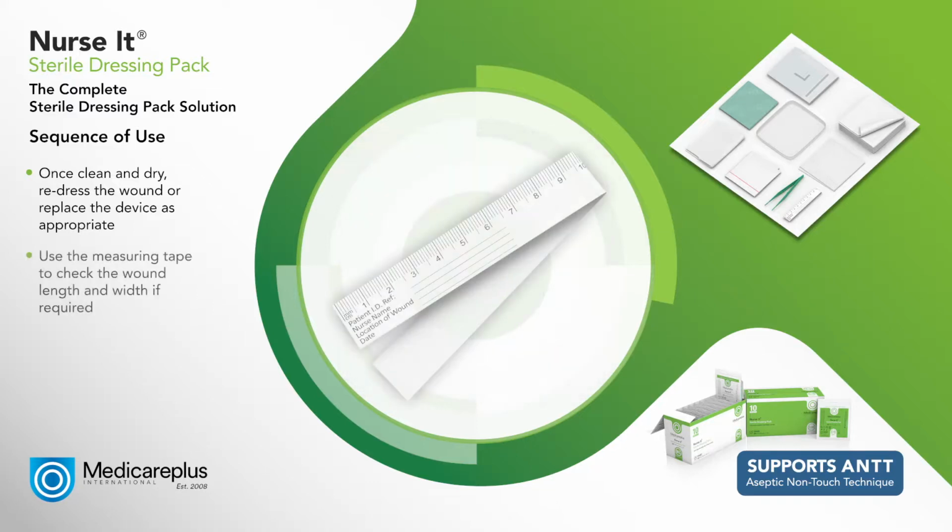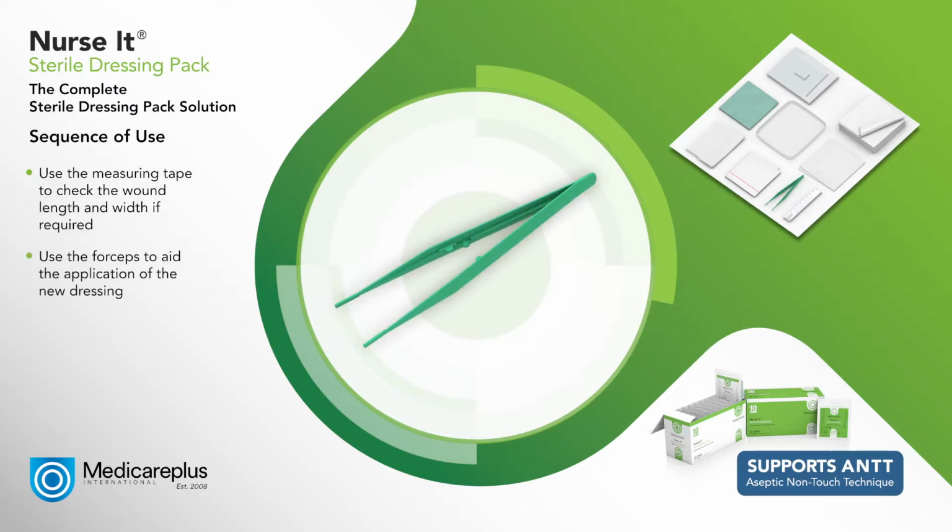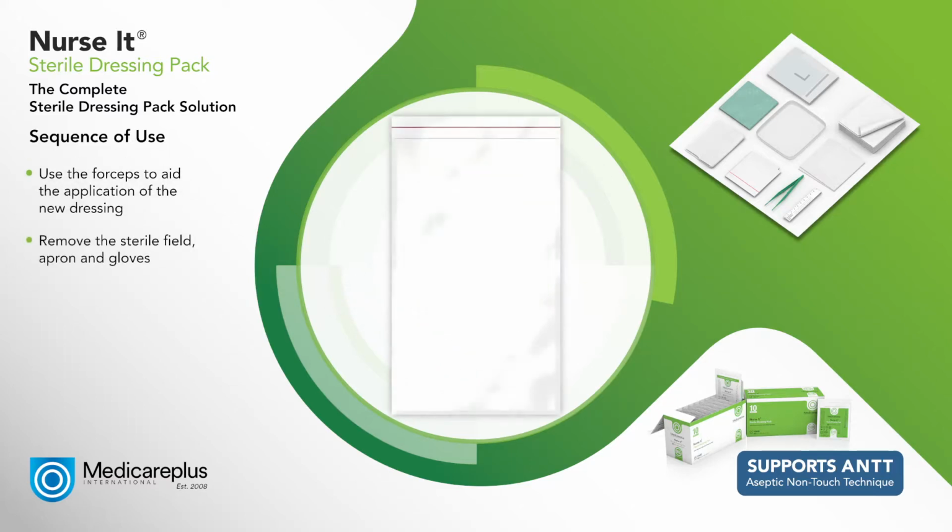Once the wound area is clean and dry, redress the wound or replace the device as appropriate. You can use a measuring tape to check the wound length and width if required, and use the forceps to aid the application of the new dressing. To finish, remove the green sterile field, apron and gloves. Dispose of all waste in the polythene disposal bag and in accordance with your local policy.